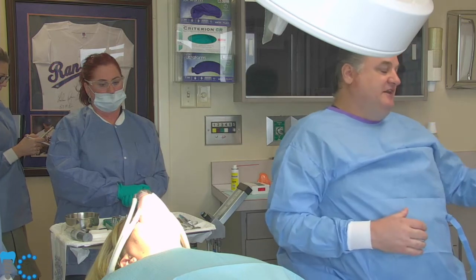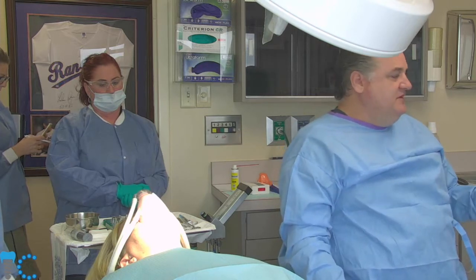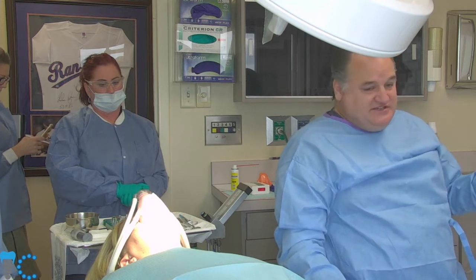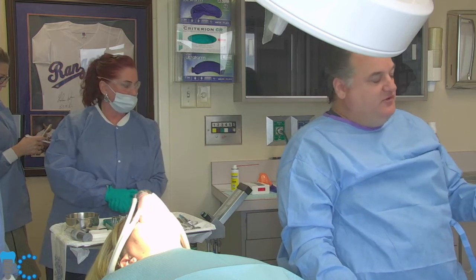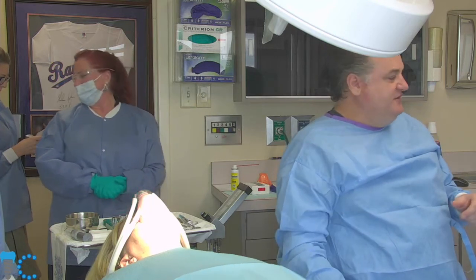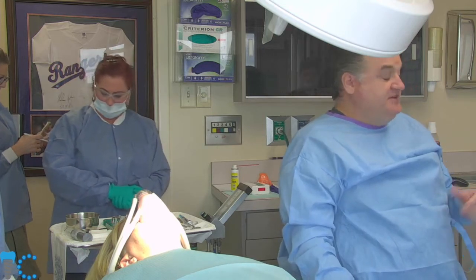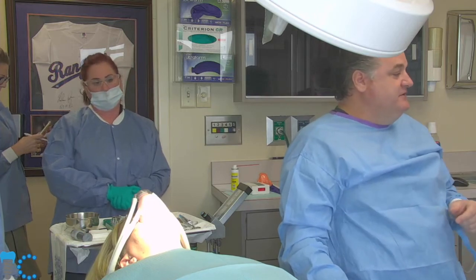And we've heard from doctors again and again who've placed these implants and similar ones under high torque and had big failure rates, and the only thing they changed in their practice was placing these implants at a lower torque setting, 30 Newton centimeters or less, and we've seen their problems totally go away. And I can show you email after email of doctors that have written me with this exact comment.